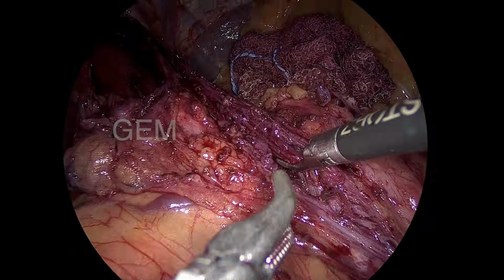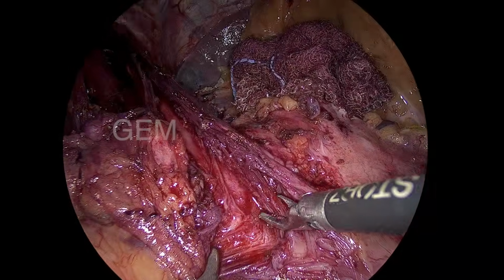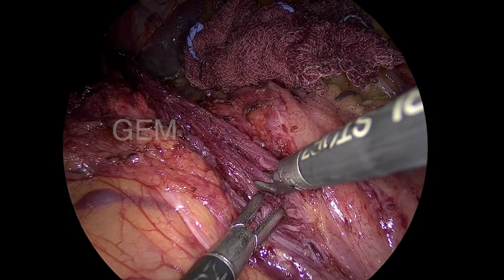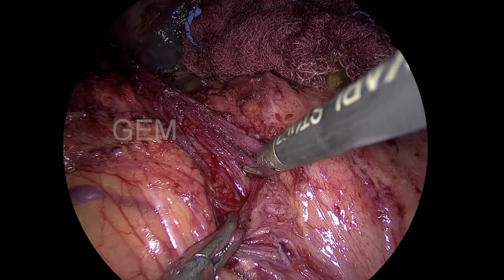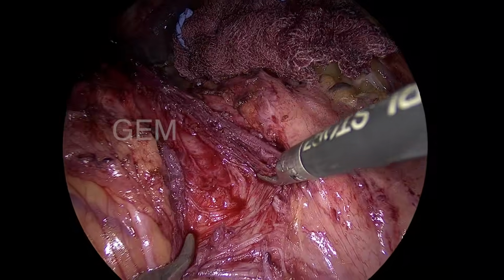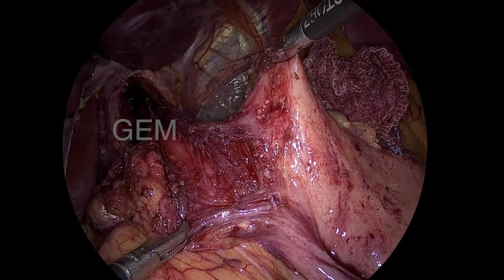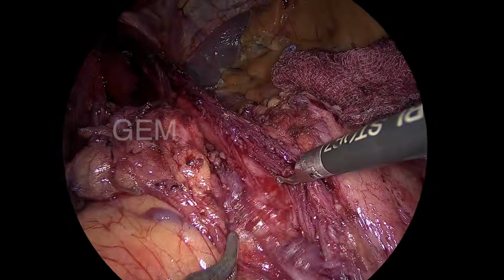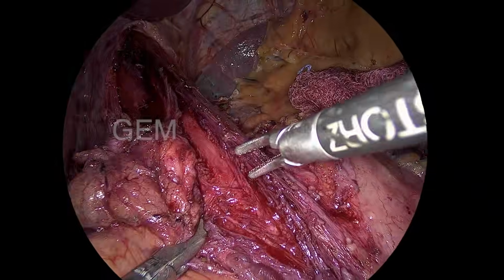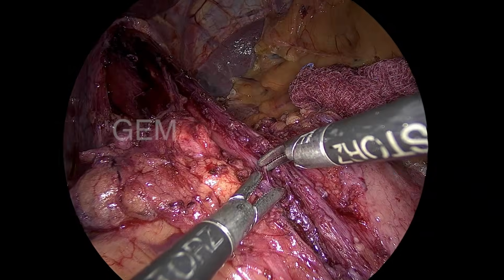Almost 180 degrees of anterior mucosa is getting exposed, and then I am doing a myotomy, followed by a Toupet fundoplication. This again retracts the muscle away, so the anterior wall of the mucosa opens up. Now you can see one muscle coming obliquely. So I am going to take this muscle, this muscle fiber, and divide it.